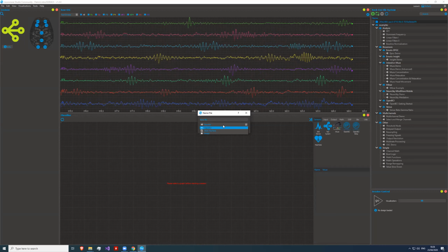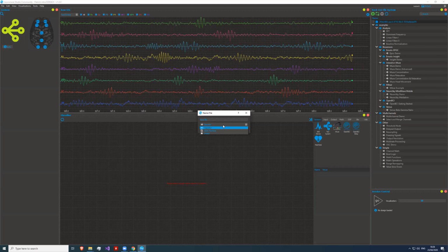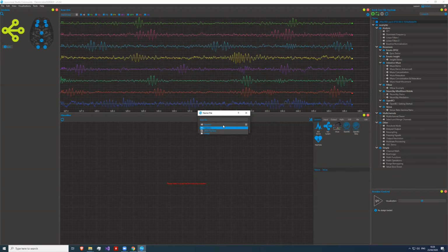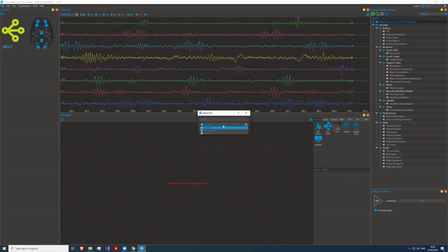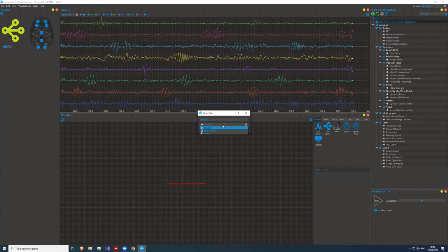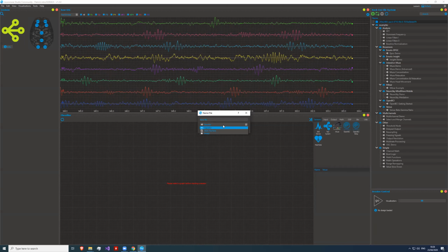Yeah, it's really about signal processing, isn't it, Patrick? Yeah, exactly. Just signal processing. The state machine itself is not about signal processing at all. It's about interactive storylines. What happens to the user? What message do we show the user at what point in time? And the state machine can be informed by the classifier. And the design is basically a combination of a state machine and a classifier.